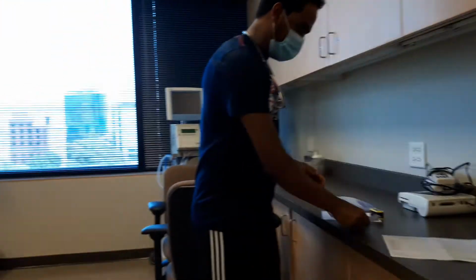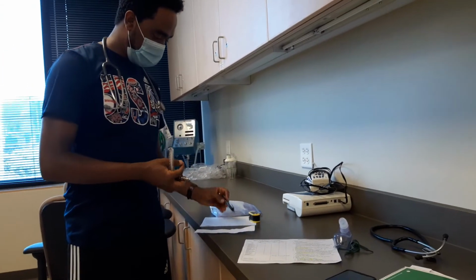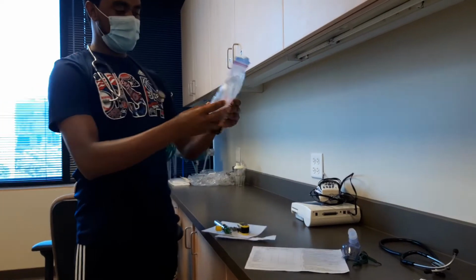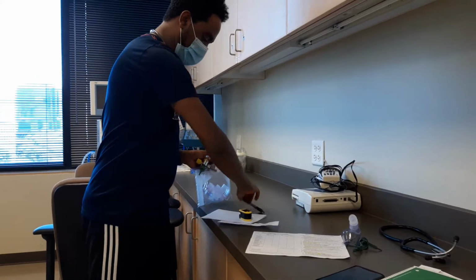And here is my order. Okay, and here's my stethoscope, flow meter, pen, paper for my documentation, pulse oximetry, and here are my supplies. So I'm going to go to the patient's room.